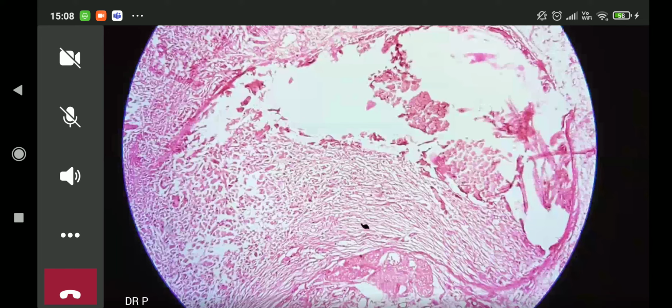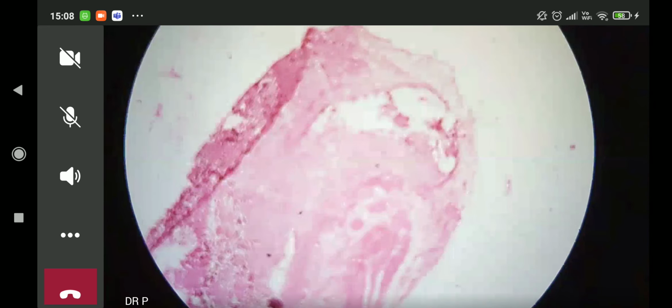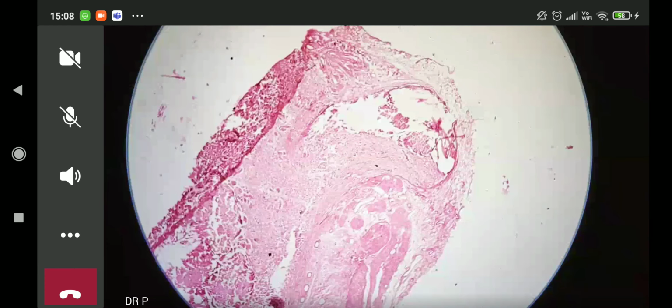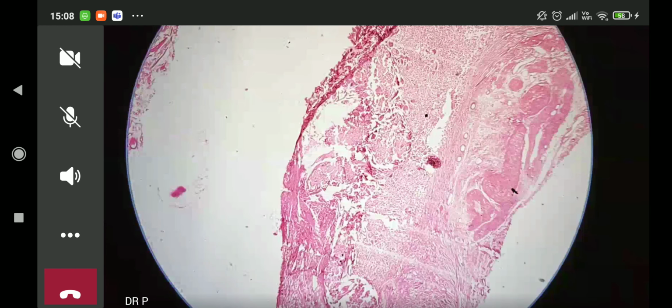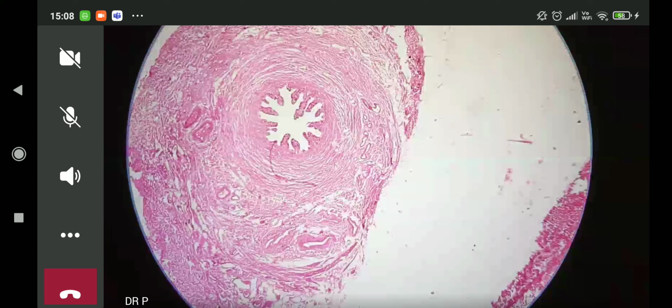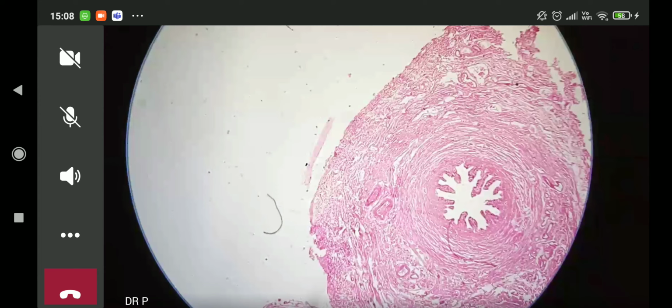Let's go to the lower part now. So we had this section of fallopian tube mucosa, serosa, all this was all okay. We have the second section, which also has a bit of serosa, which has thickened blood vessels, but you have one weird looking area here.